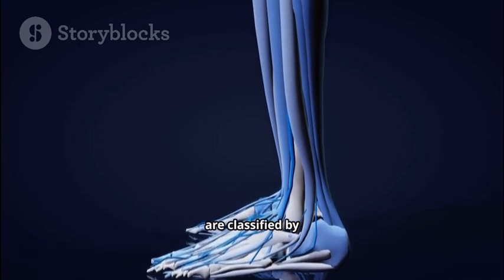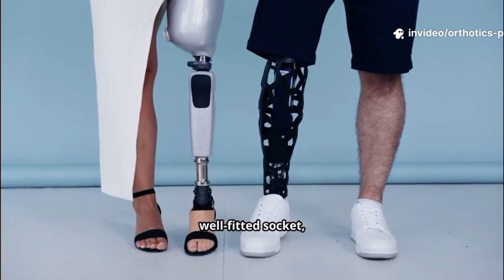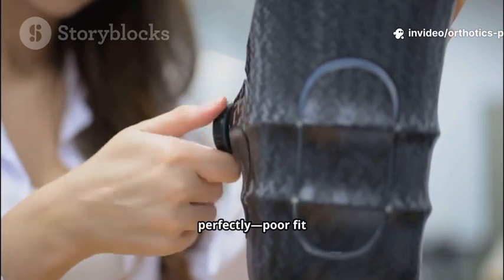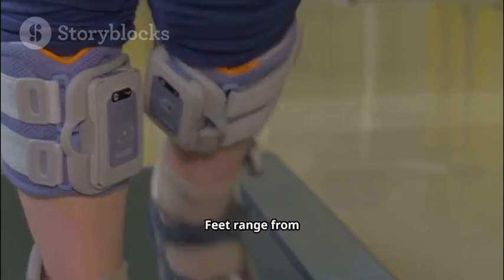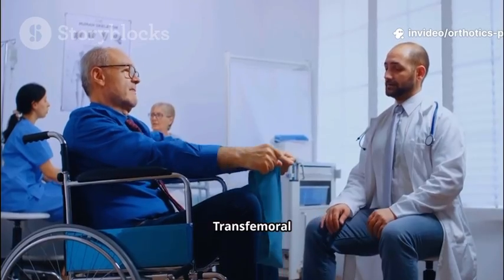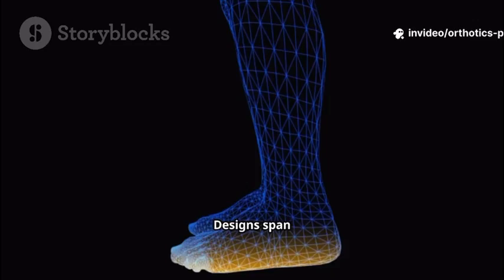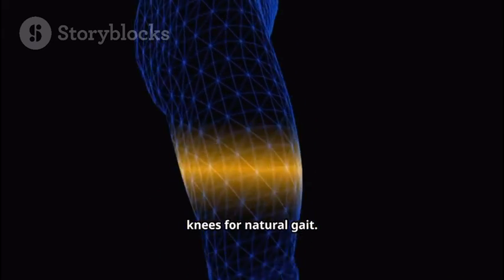Prosthetic devices are classified by amputation level. Transtibial prostheses include a well-fitted socket, a pylon, and a prosthetic foot. The socket must fit perfectly. Poor fit causes pain and skin breakdown. Feet range from simple solid to advanced energy-storing designs. Transfemoral prostheses add a knee unit, making the system more complex. Designs span manual lock hinges to microprocessor-controlled knees for natural gait.